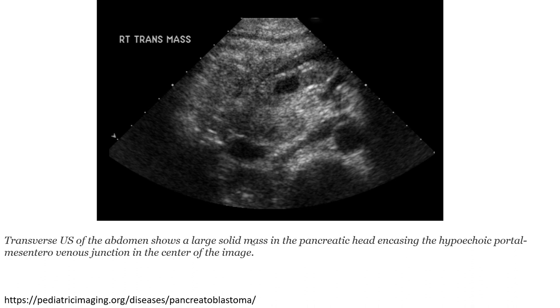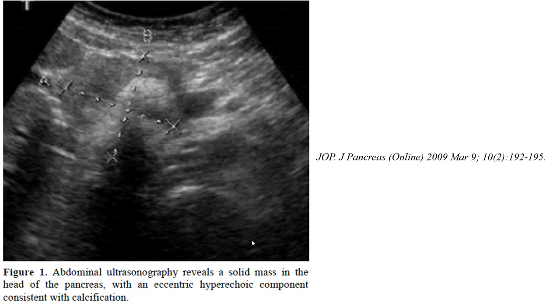This is a case of pancreatoblastoma on ultrasound, where it shows a large solid mass in the pancreatic head encasing the hypoechoic portal-mesenteric venous junction in the center of the image. This is also a case of pancreatoblastoma on ultrasound, where it shows a solid mass in the head of the pancreas with an eccentric hyperechoic component consistent with calcification.